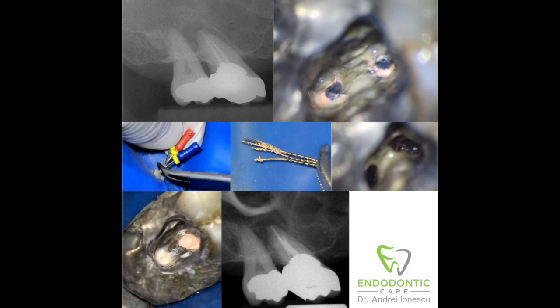This is a quick video demonstrating the removal of a thermofill carrier using a braided Hedstrom technique. The technique involves using lots of chloroform to soften the gutta-percha around the plastic carrier, then using three Hedstrom files which are intertwined together to engage and remove the carrier. I find this to be a very useful technique — it's pretty straightforward in stubborn cases where the carrier is engaged tightly into the canal and putting up a fight.